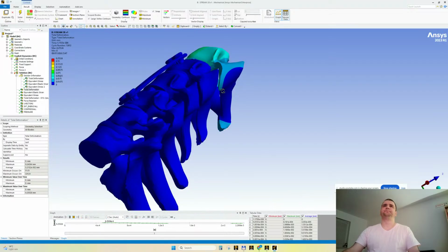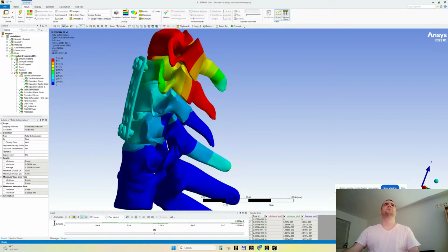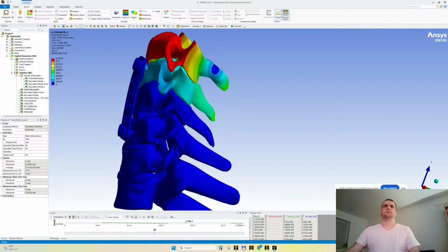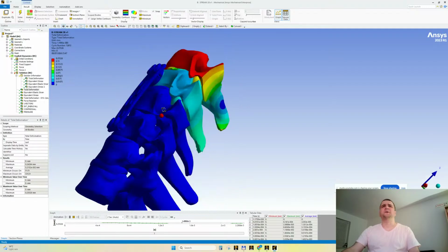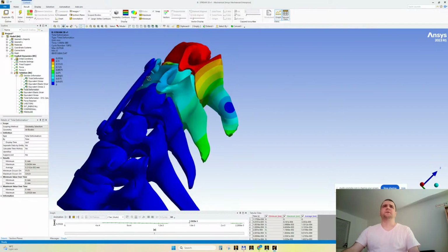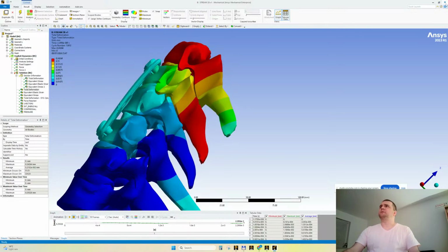Let's animate a little. Let's assign auto scale. Yeah, this is a little better. Let's make the cartilages stiffer with 24 megapascals Young's modulus. Super, we're on a very good track.